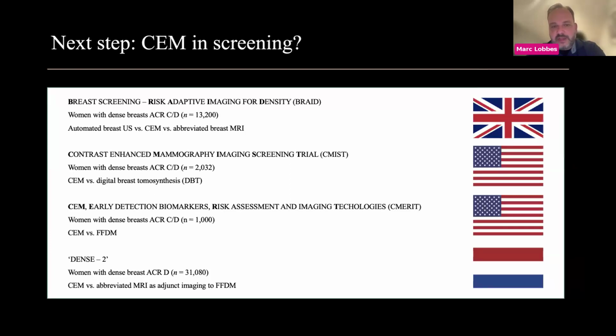I think breast MRI is a very nice tool. It's always been, but it's rather expensive and its availability is quite limited. So why not do contrast-enhanced mammography where we can do it and save up the precious MRI time for women that really require it: difficult cases, maybe a large background enhancement, people who are hypersensitive to iodinated contrast agents. There's really a selected population that we can still do sufficient numbers of breast MRI with.